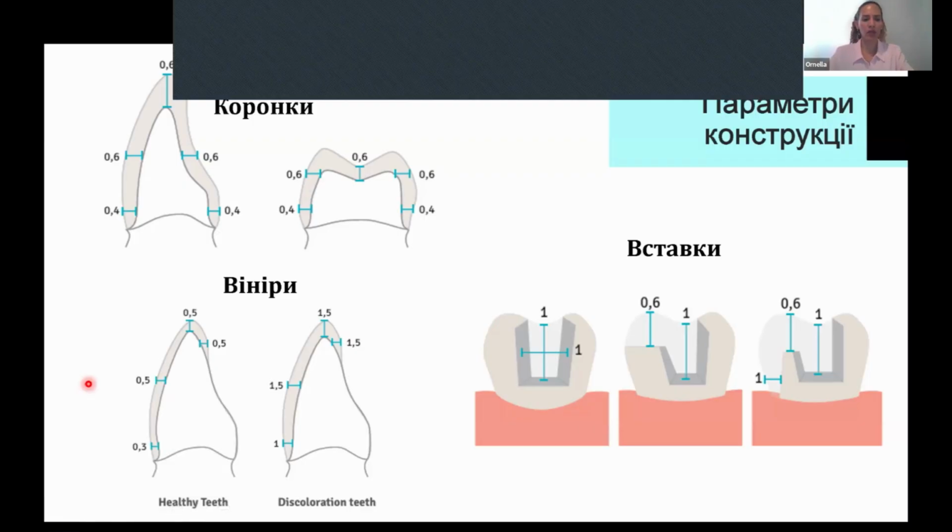And also in the case of the veneers, if my tooth is healthy, what I mean with this is that the color of the background is okay, I could go to lower thickness, because it's going to transfer the color of the background and it's going to integrate better, it's going to be more natural. So I'm going to establish my minimal thickness at 0.5.